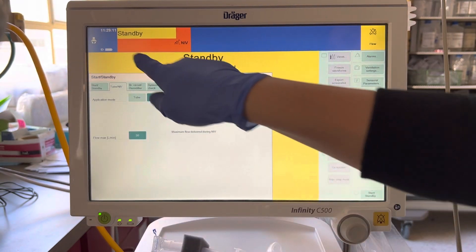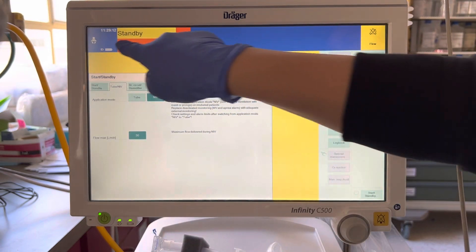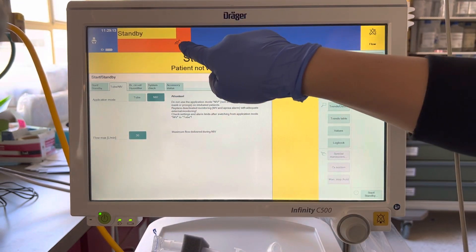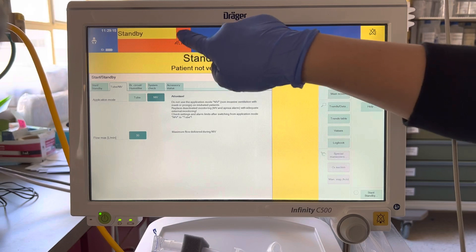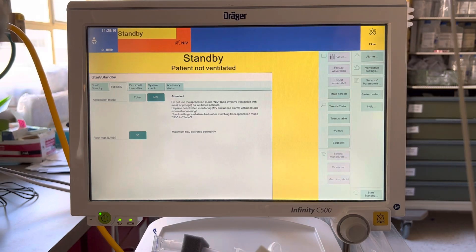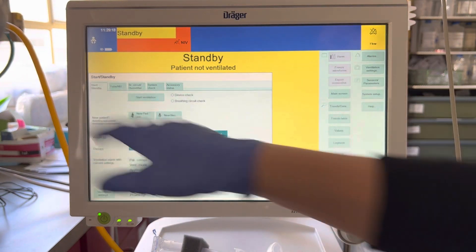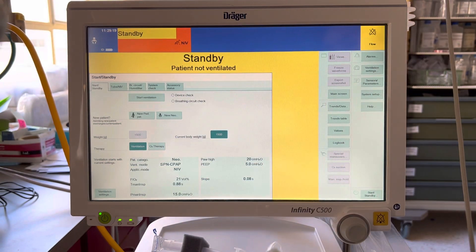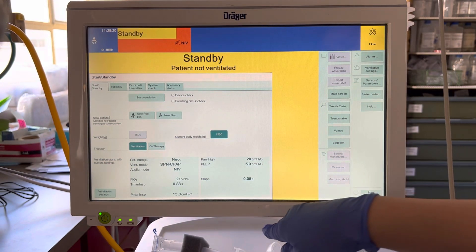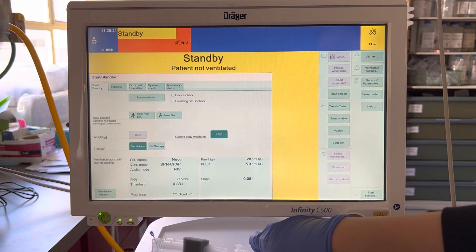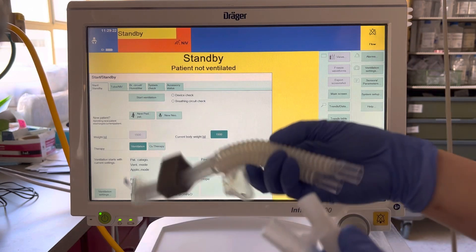You're also going to see a change in orange right here — you're going to see an NIV logo on the top. Go back to start standby. Now let's go ahead and do a breathing circuit check with the flexi trunk.